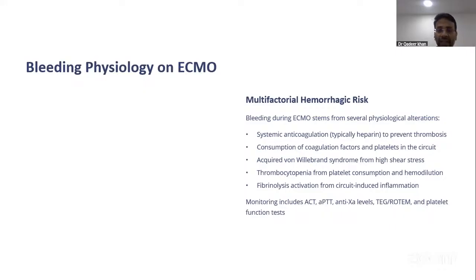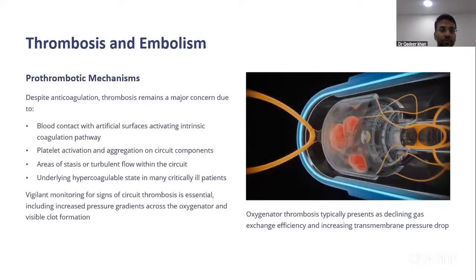Bleeding is again because of the hypothermia that can happen, and because of the coagulation cascade activation from the inflammatory response of the ECMO. Thrombosis, where we need to maintain a proper anticoagulation to prevent the membrane from getting clogged and to have adequate oxygenation.